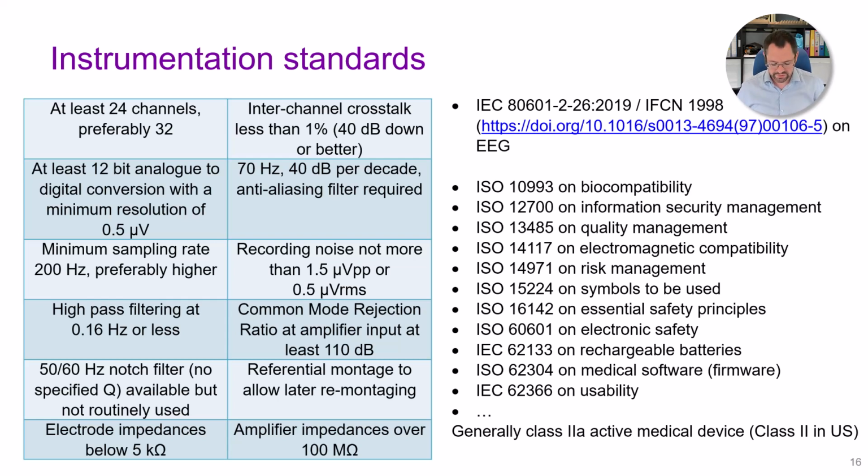You can see they've given a recommendation for the amount of low-level electronic noise that can be present. There's always going to be some noise, we can't get rid of it completely. They give a standard for what the impedance should be in a passive electrode case, in order for there to be a good connection to the body. And these are things that you might want to bear in mind when you're comparing different units or looking to set up your own unit.